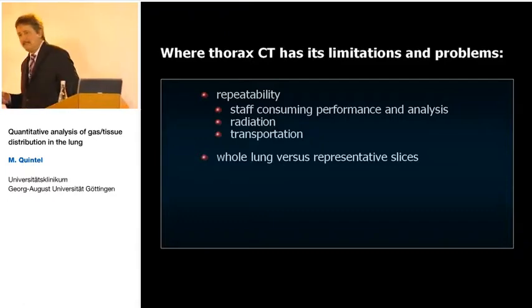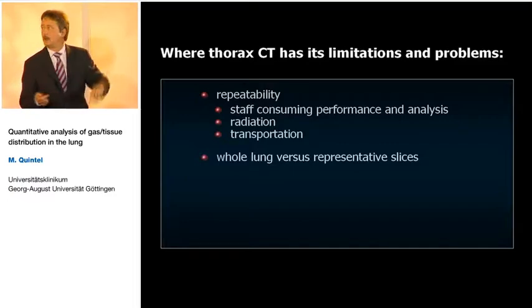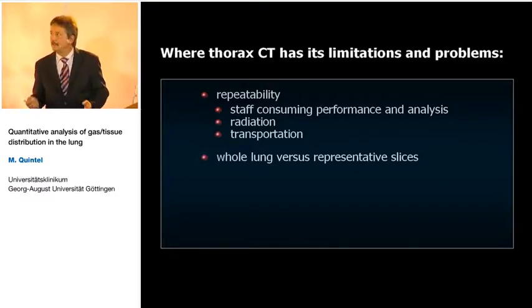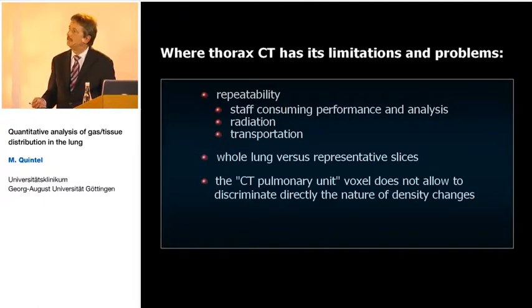We have an ongoing discussion, is it sufficient to use only 3 slices, or do we need really whole lung CT scans to really make a good prediction of what's going on?